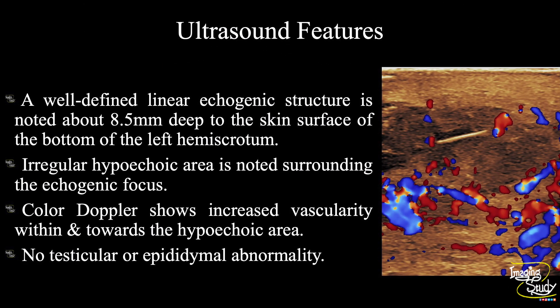In summary, a well-defined linear echogenic structure is noted about 8.5 mm deep to the skin surface of the bottom of the left hemiscrotum. Irregular ill-defined hypoechoic area is noted surrounding this echogenic focus. Color Doppler shows increased vascularity within and towards the hypoechoic area. There is no testicular or epididymal abnormality. So, these features suggest a case of foreign body impaction within the scrotal skin with surrounding granuloma formation.